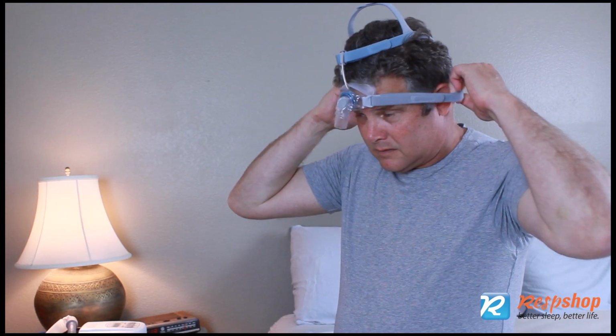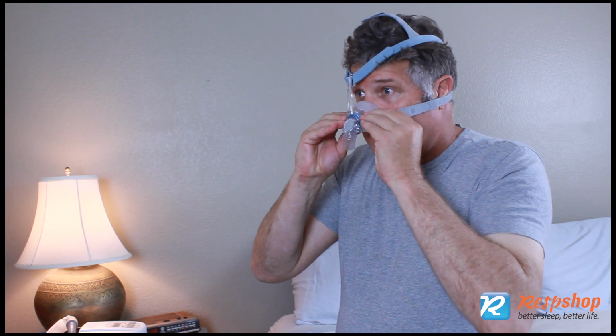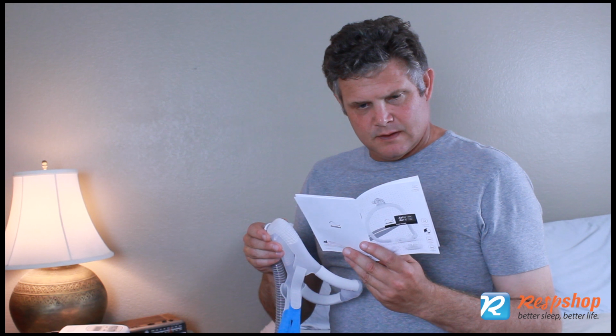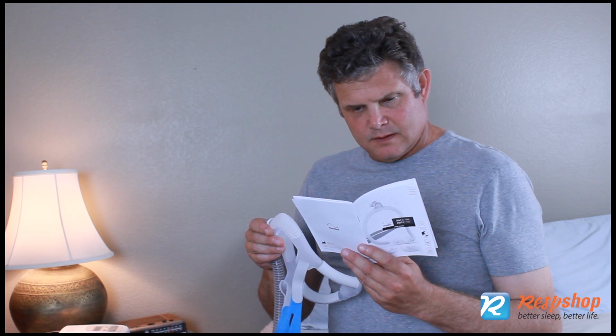The Fisher and Paykel directions tell you to put the headgear on first, then move the cushion to the face. But ResMed's N30i guide instructs you to hold the cushion to the face and then pull on the headgear. Follow the directions of your mask to the letter and see if that jumpstarts your fit each night.